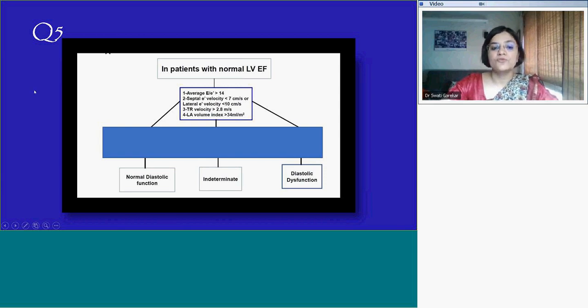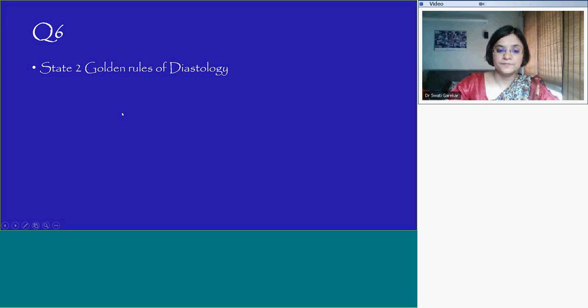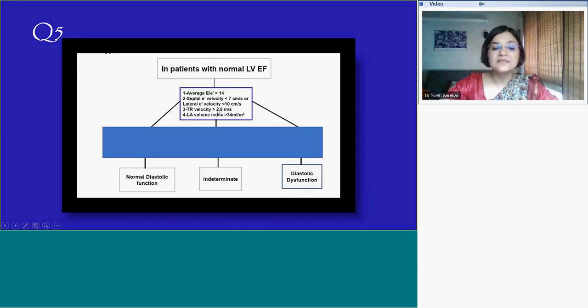You want more than 50% of these abnormal. You can use these numbers for adults, and for pediatrics, try and use your charts for the diastolic dysfunction range.